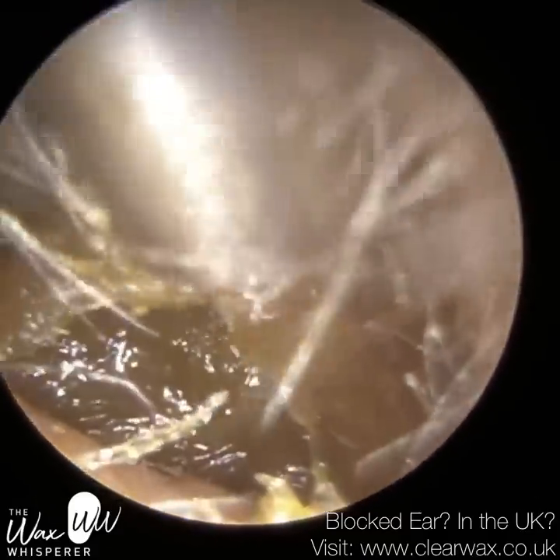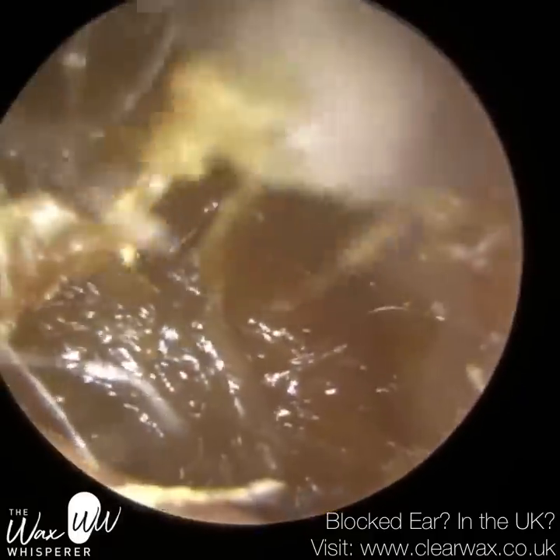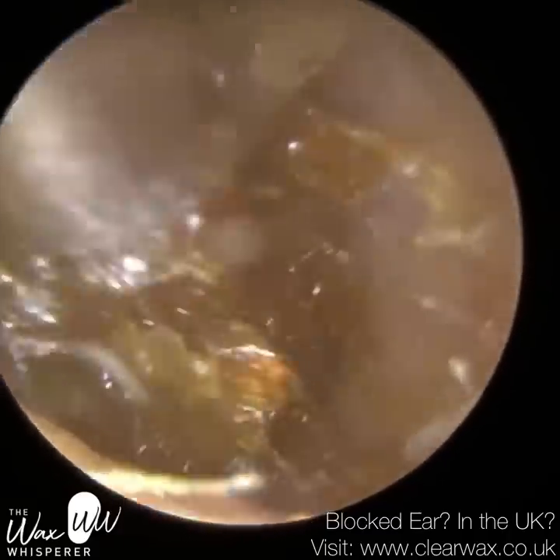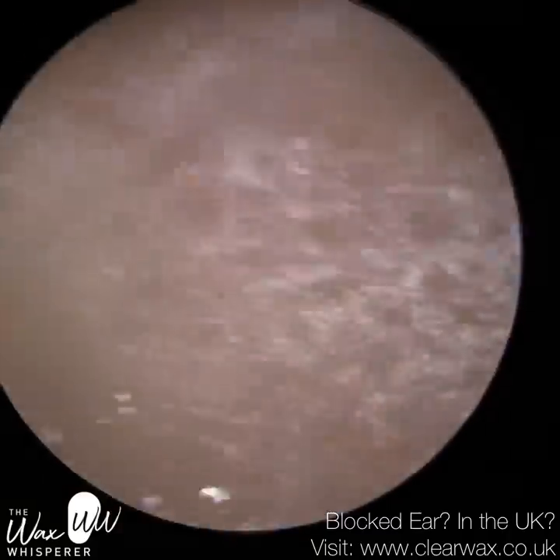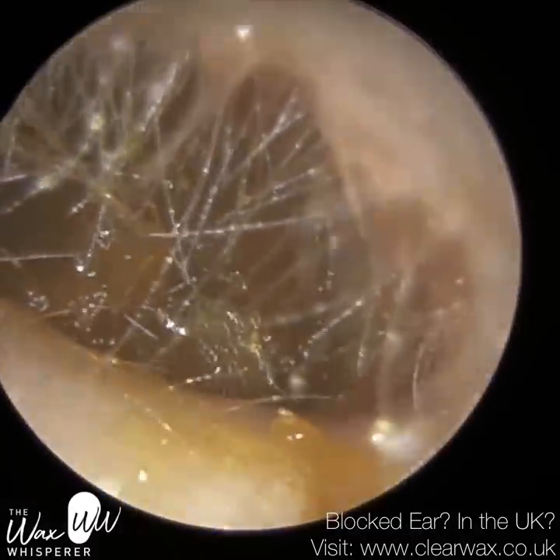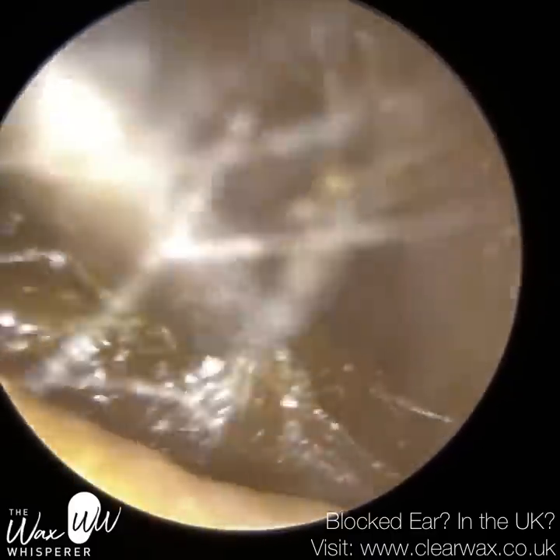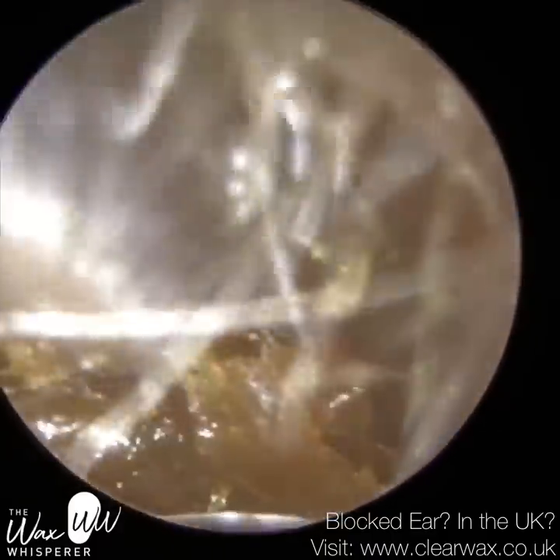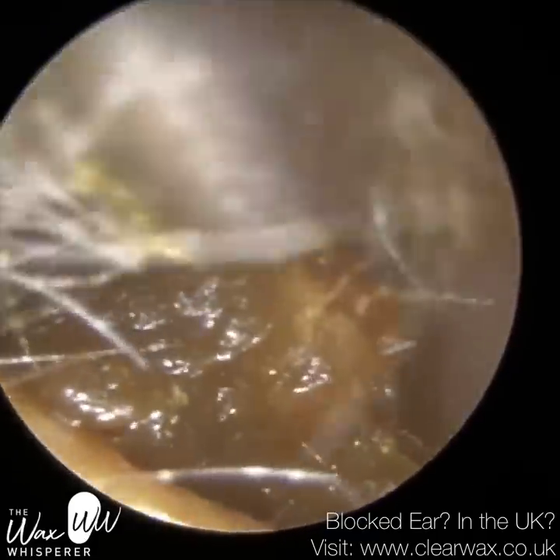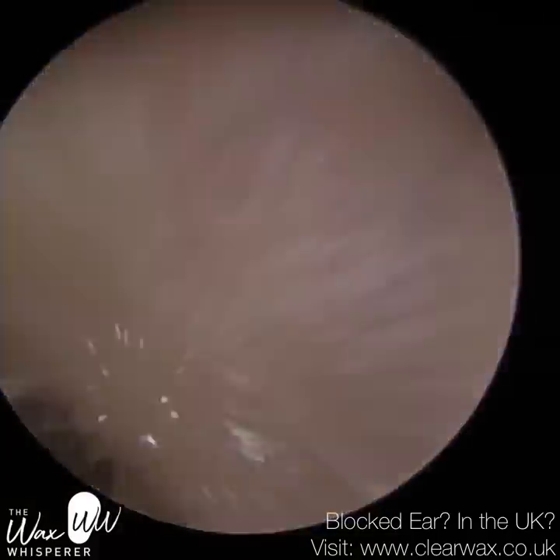There are many different types of suction probes available, and the Zoellner suction probe is the most suitable for aural microsuction. The outer diameter of the Zoellner suction probe is 2.1 millimetres, and the internal diameter is about 1.7. You can get larger suction probes like the McGill suction probe, which is 3 millimetres outer diameter. However, that's just too large for the ear.